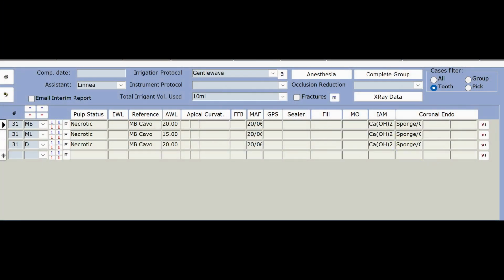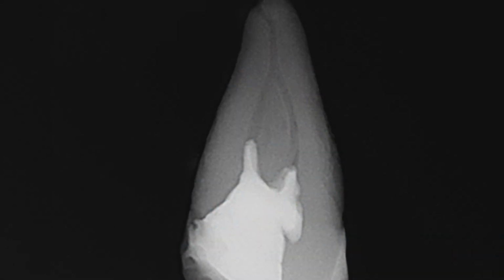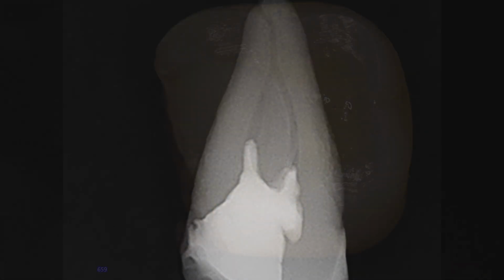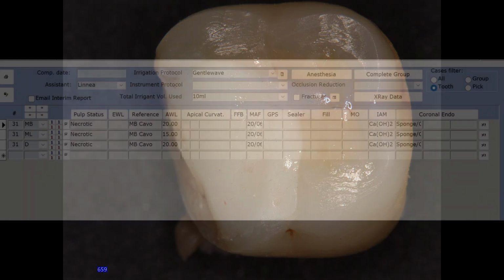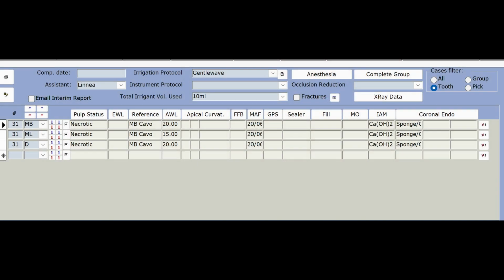We irrigated the tooth with the original Gentle Wave molar handpiece, and I left the canals empty and placed Cavit coronally. Composite was bonded coronal to the Cavit. The treatment page mistakenly lists the use of calcium hydroxide. I did not use any calcium hydroxide.